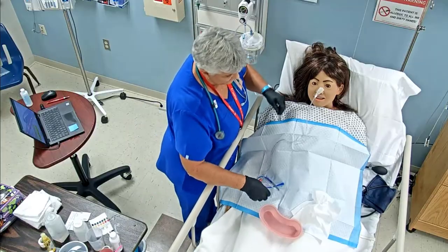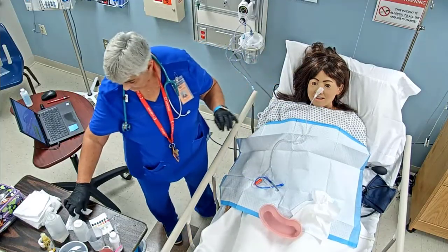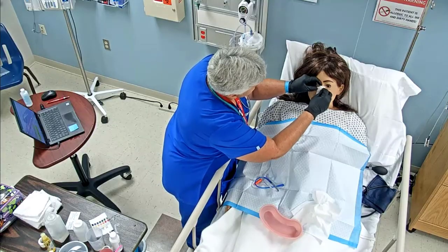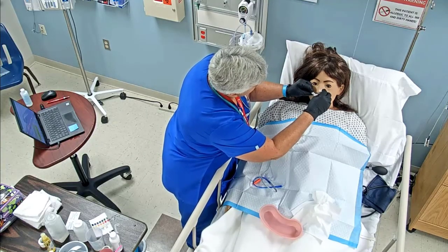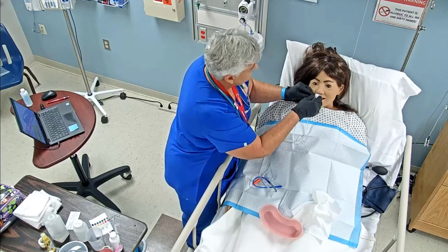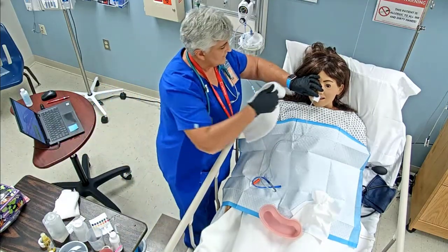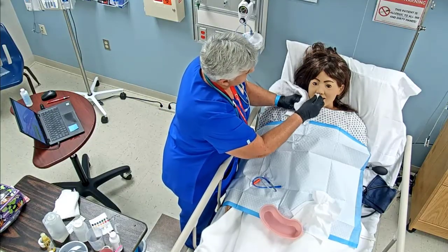Once I've checked placement, I'm going to use my adhesive remover and make sure we get all of that. As I'm doing that, I'm checking for skin integrity. While we had done all this, we had been checking for skin integrity. Then I'm going to get a towel. So I've got that all clear.